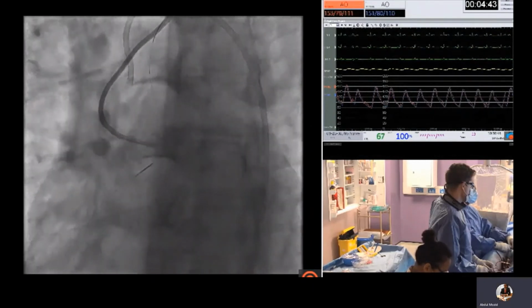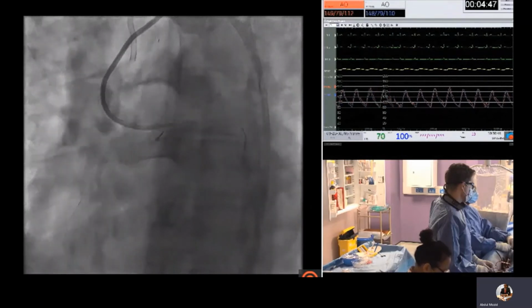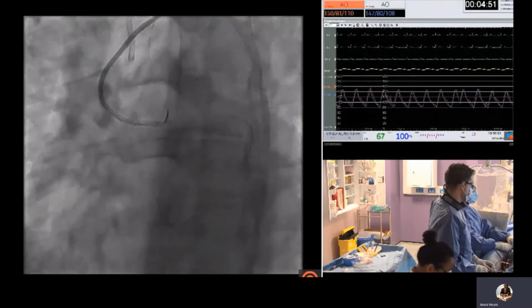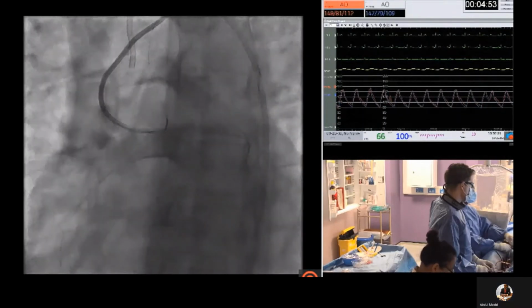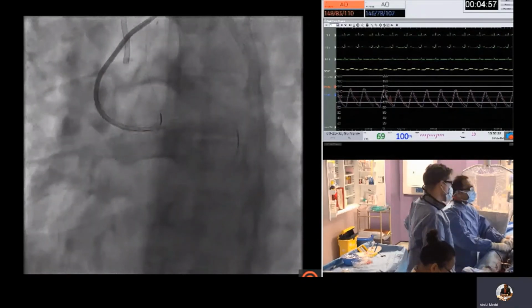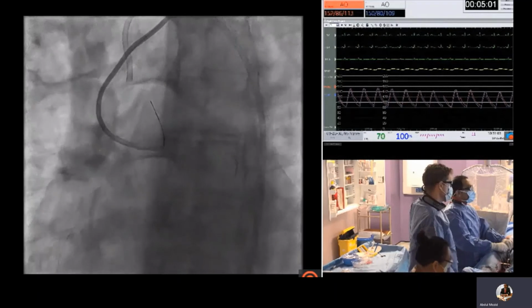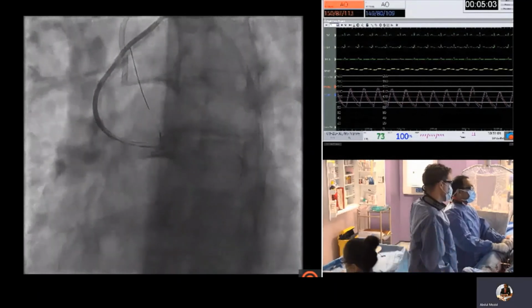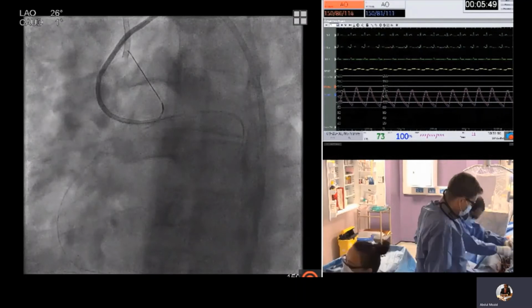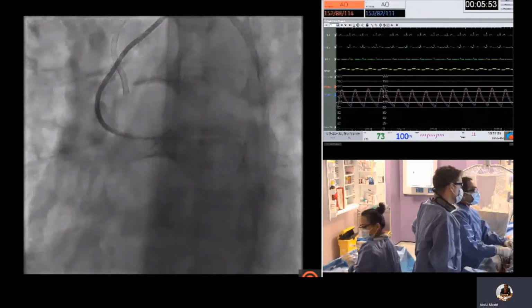If the right coronary ostium was in a more classic position, we could have now engaged the antegrade guide catheter and tried to wire the guide catheter. Given the anterior origin, we had already spent some time failing to engage right, so we felt that snaring would be the most efficient method.